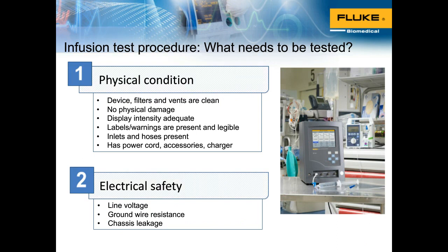The first thing you test is the physical condition: the device itself, the filters. Are the vents clean? Is there any physical damage to the instrument? What about the inlets and hoses? So all the physical characteristics of the pump have to be evaluated to ensure that they are in good condition.